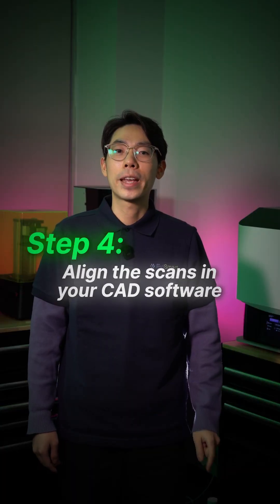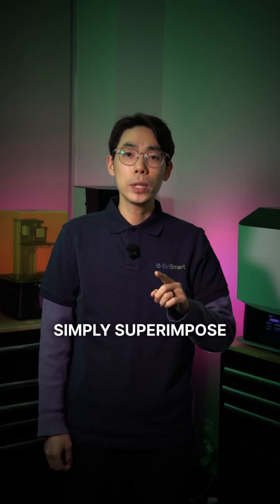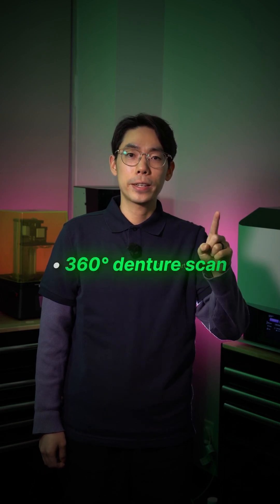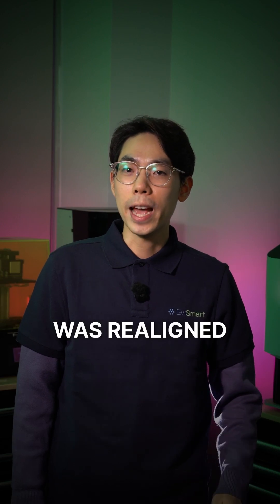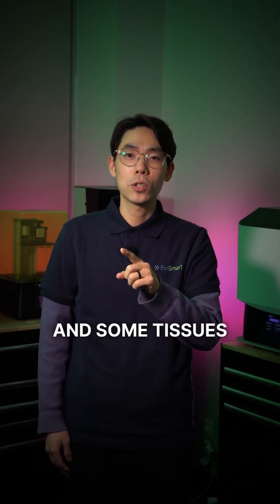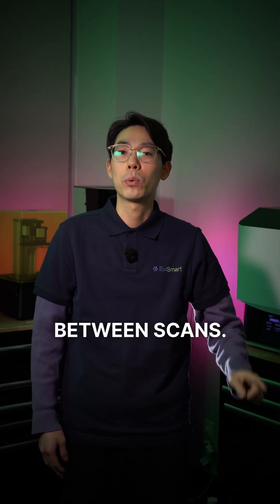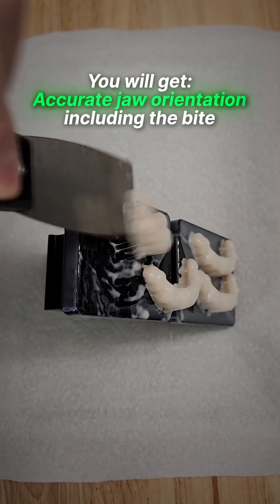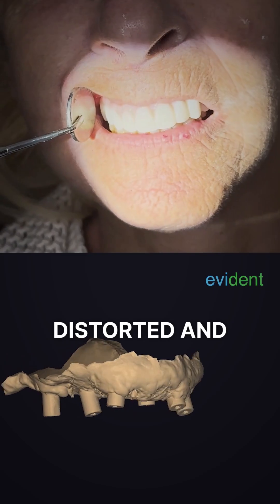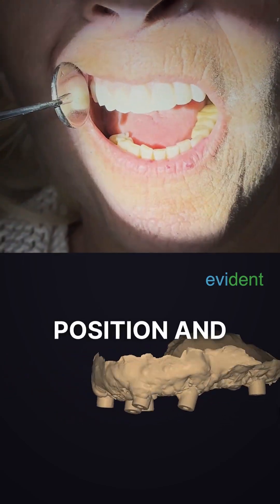Step 4: Align the scans in your CAD software. In ExoCAD, simply superimpose the 360-degree denture scan with the scan taken on the day of surgery. Because the denture was relined and the hard palate and some tissues that have not changed match between scans, you will get accurate jaw orientations including the bite, without tissue distortion or misalignments.